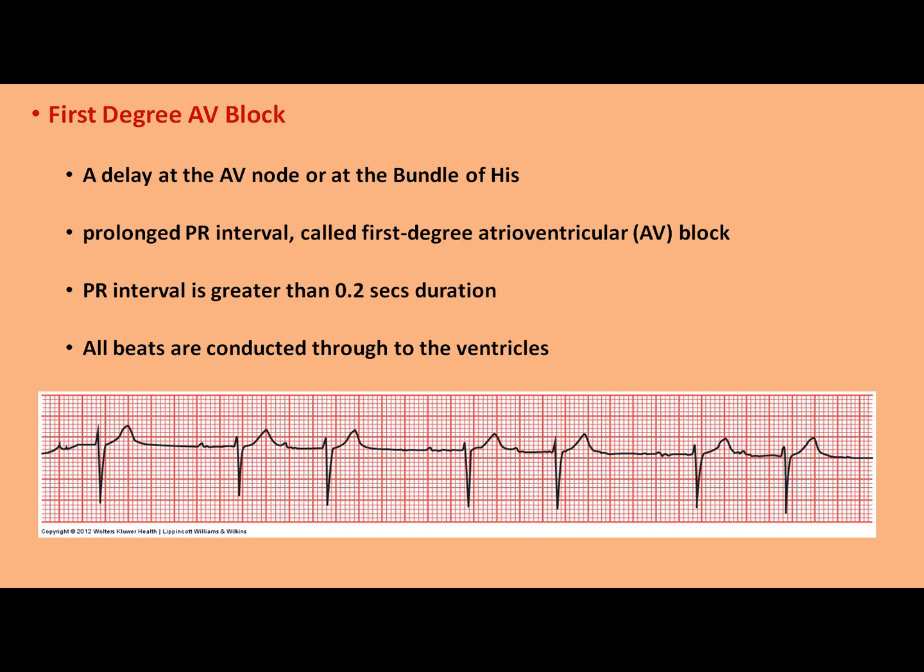So we had this EKG earlier. Here's a P wave, here's a QRS complex. See how long this is? P wave, QRS, P wave, QRS, but it's long. So this is the first degree block. Most of the time it's not a big problem, but sometimes it can be.